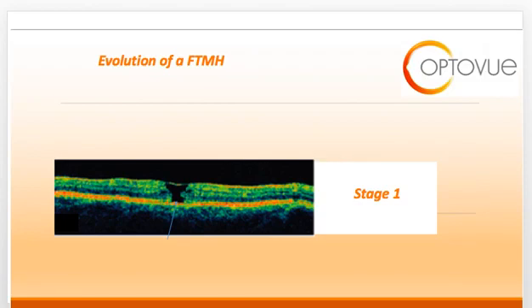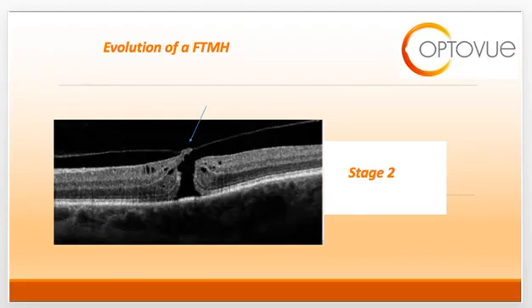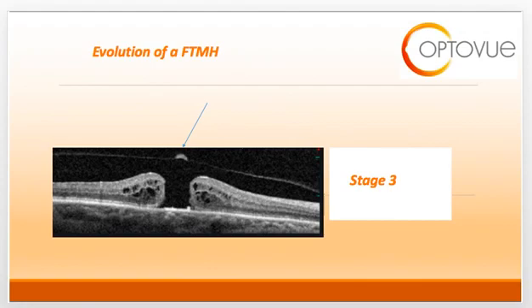A stage one full thickness macular hole shows the development of a pseudocyst formation. A stage two macular hole involves the partial opening of the pseudocyst with focal vitreous attachment — the blue arrow points to that residual vitreous attachment pulling the retina open. In a stage three hole, there is release of the vitreous traction with operculum formation. The blue arrow points to the operculum suspended or attached to the vitreous, resulting in a full thickness defect from ILM all the way to RPE. You can also see cystoid hyporeflective spaces on both the nasal and temporal sides of the fovea from chronic vitreous traction.